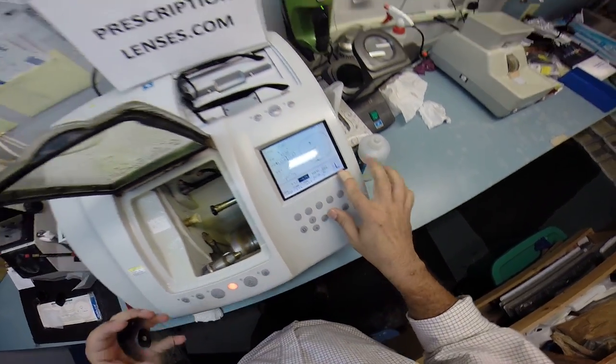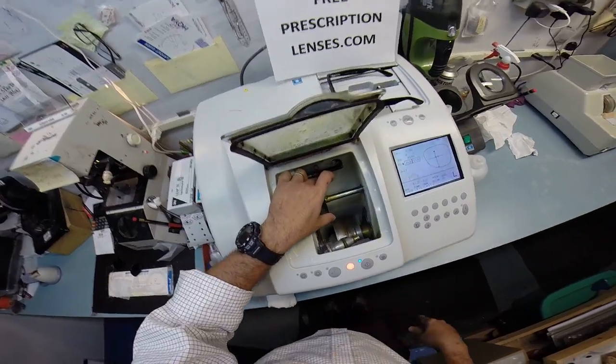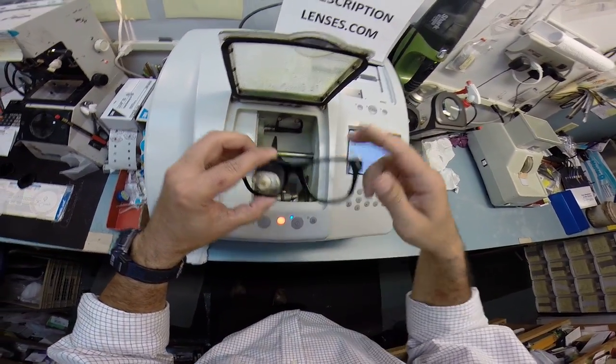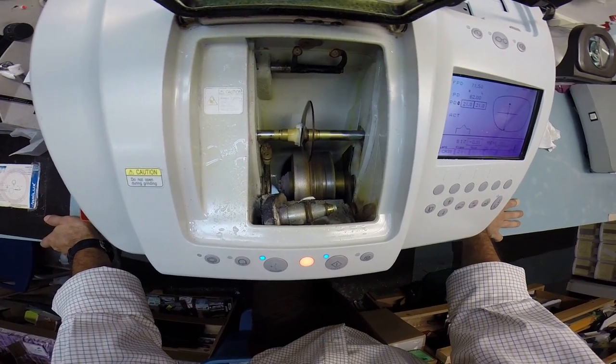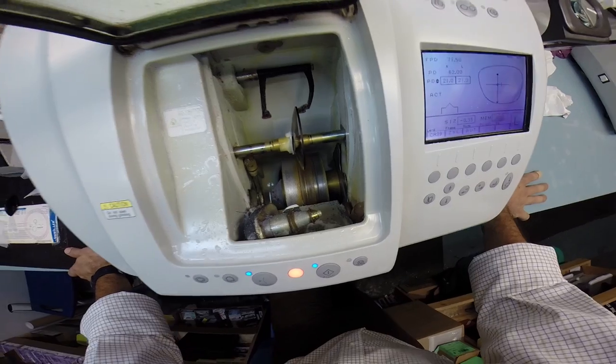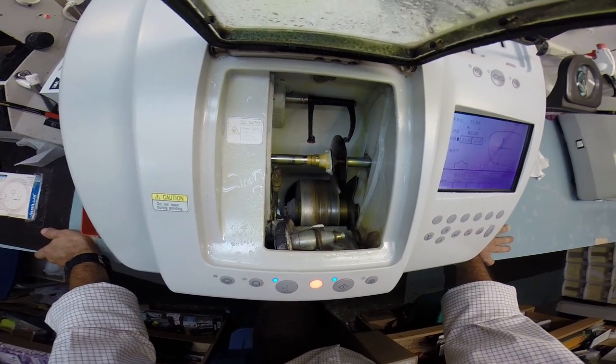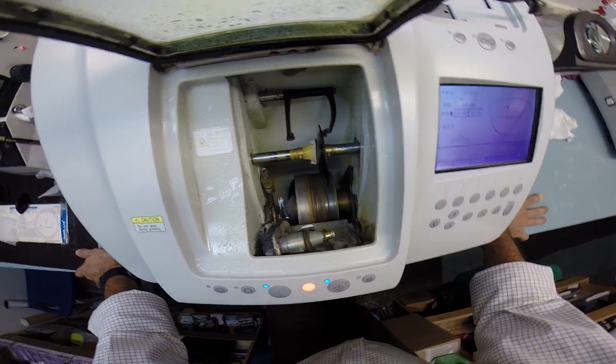Flip that, make the R and L and hit start. And just like before, the caliper is going to come down, but this time they're going to trace the shape of the left side of the frame to make sure the lens is large enough to fit. Always starting with the concave rear surface and then it's going to move over and trace the convex front surface. And that concludes your vocabulary lesson of the day.